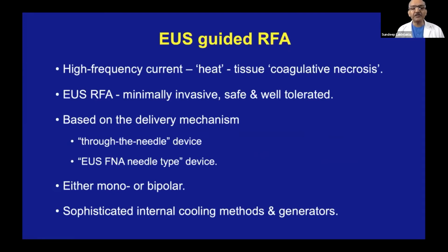And this heat, which is provided at the tip of the needle, can vary from 1 centimeter to 2 to 3 centimeter, depending on what type we are using. This heat causes controlled coagulative necrosis, and that burns the tumor. So it's minimally invasive, safe, and well tolerated.